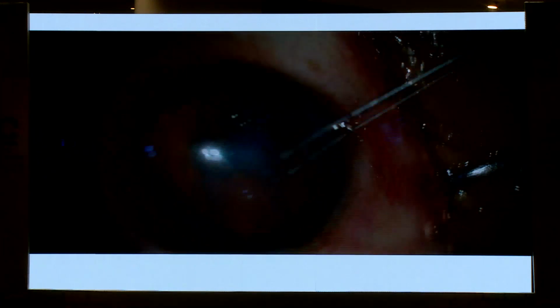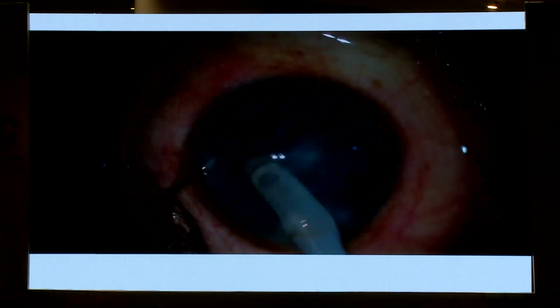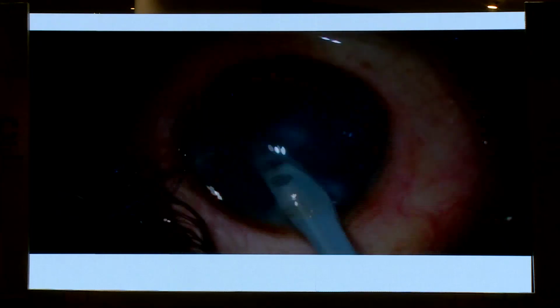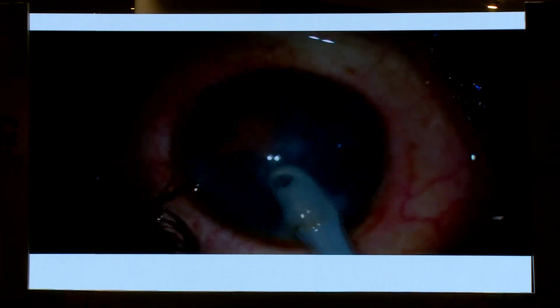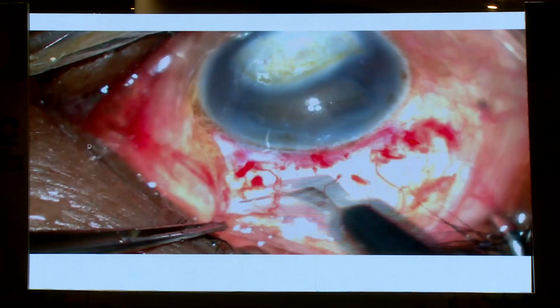The whole surgery, usually I don't do it in this red glow alone, because it gives a good rhexis, but in terms of the nuclear management, I am comfortable with both the red glow and the normal light. Even here you can see that the area where I am able to find a bit of clear cornea is where my phaco probe is, and don't go underneath the area of the scar.